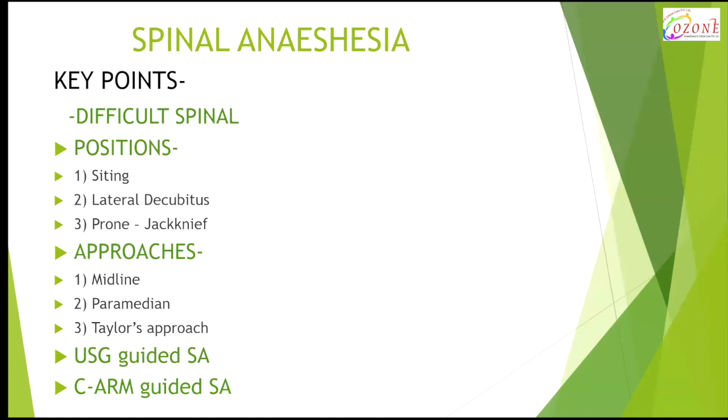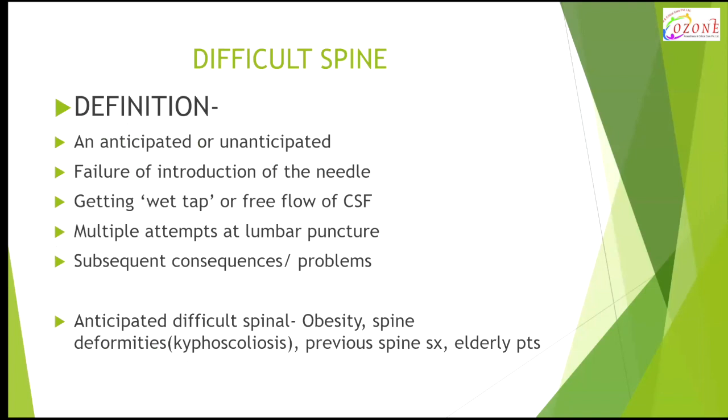So in this topic, we will discuss difficult spinal. Then we'll discuss different positions, that is sitting, lateral, and prone. We'll discuss approaches: midline, paramedian, Taylor's approach, and we'll also discuss the recent advances like USG guided spinal anesthesia and C-arm guided spinal anesthesia.